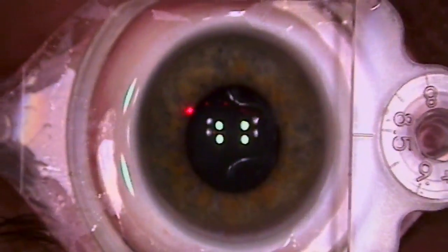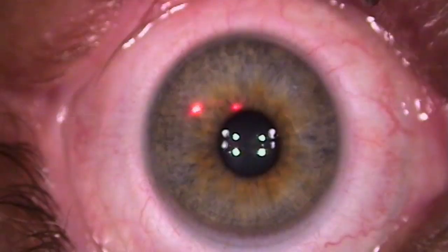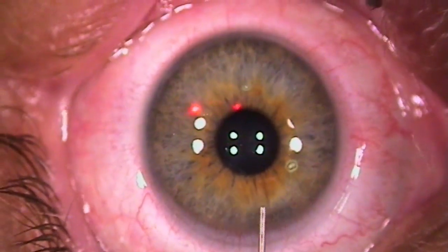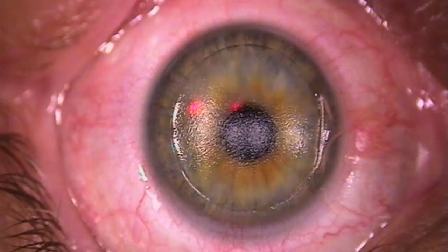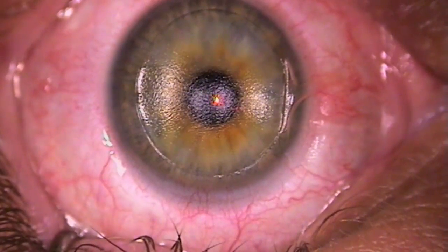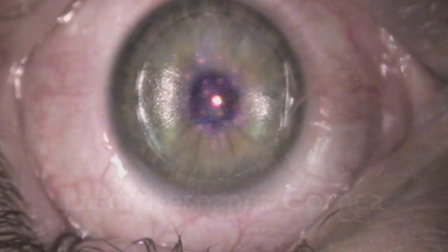I'm going to push again — everything's going to get dark again, getting pretty dark. And then it's going to come right back on again. A little bit of clicking noise again. You're doing well — perfect.